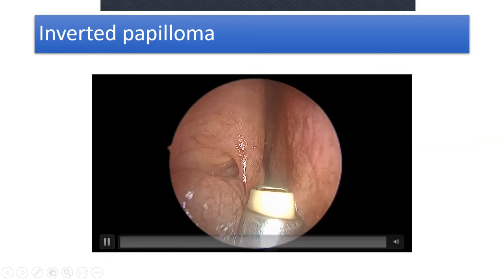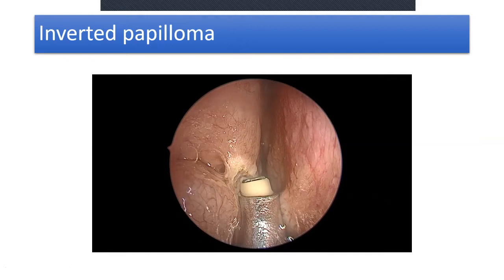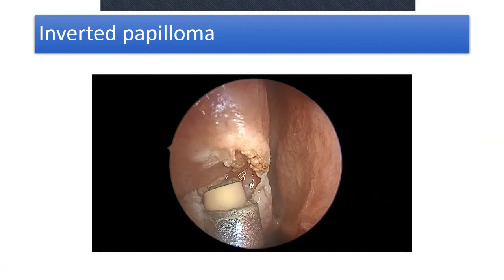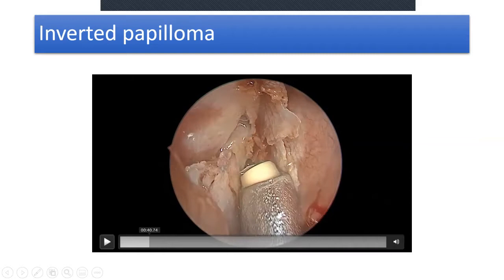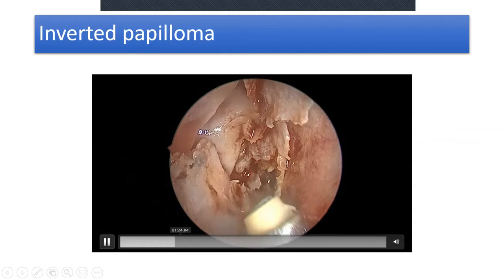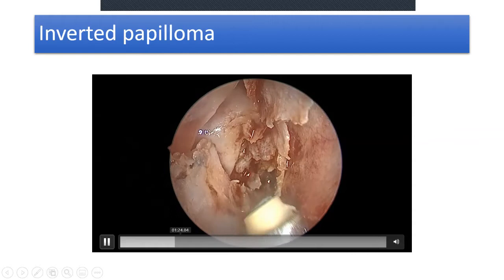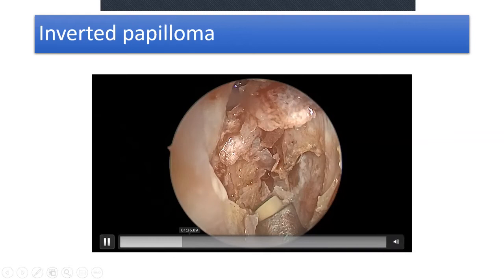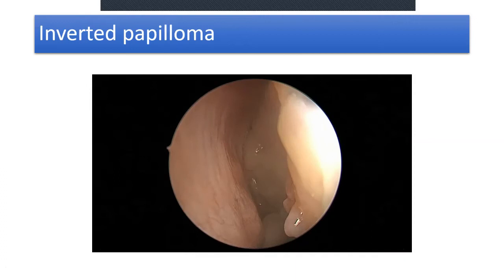This is a limited inverted papilloma — Krouse grade 2 using the Krouse classification. Using coblation to clear off the middle turbinate. Since coblation can cut, ablate, and coagulate at the same time, it is a wonderful tool to use in the nose — but only for ablative surgery on tumors, not for any kind of functional surgery.